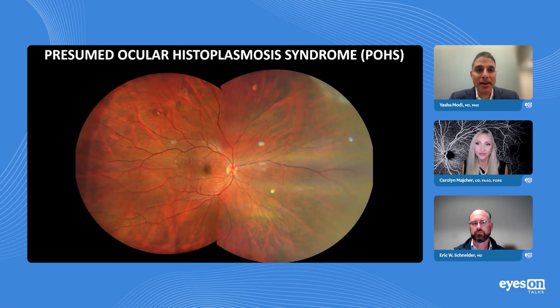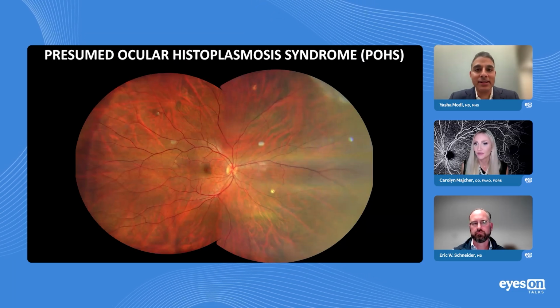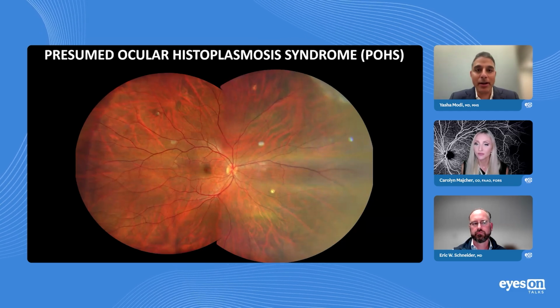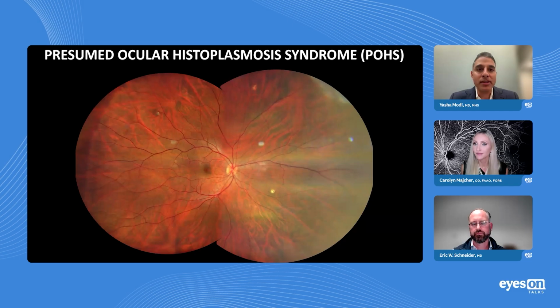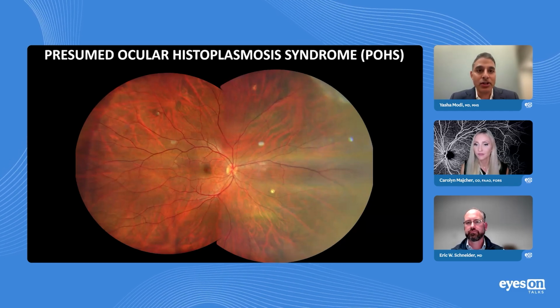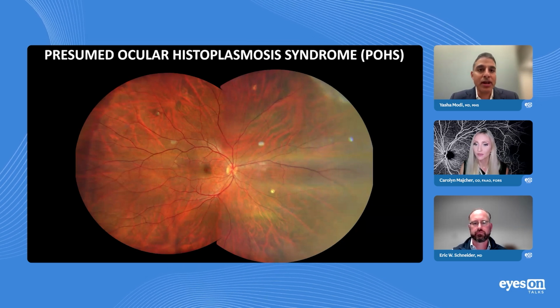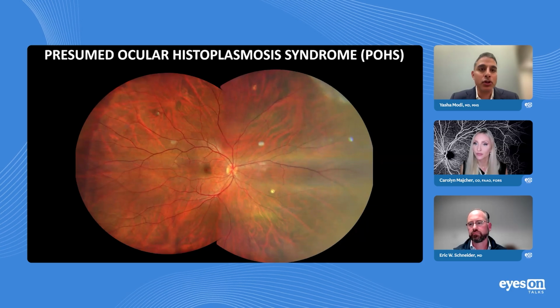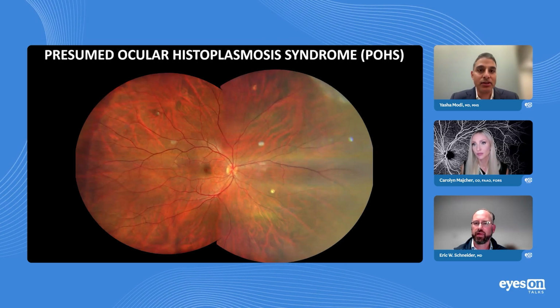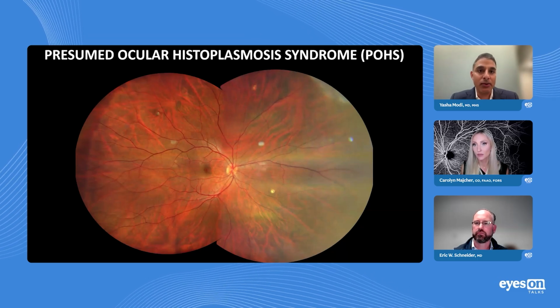Carolyn, what a cool case, and I think to even have that insight that this may be an inflammatory neovascularization was incredible. Eric, inflammatory CNV certainly looks different than your classic neovascularization or type 2 neovascularization, which may just present with SHRM. So just for the viewers, any tips on what we should be looking for to identify that type of inflammatory neovascularization? Do you use OCTA, or does the structural OCT give you enough information to make that judgment?